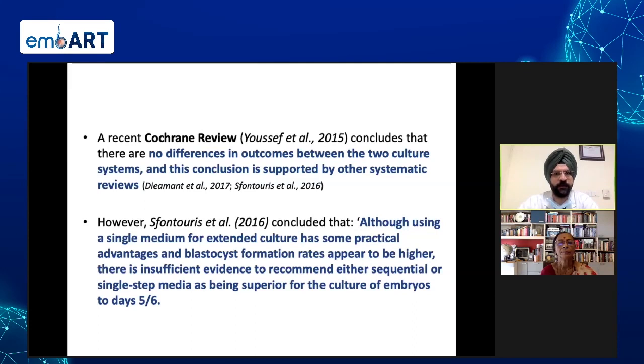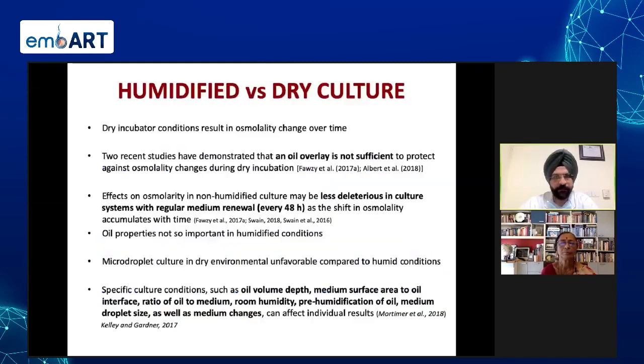If you look at the evidence, a recent Cochrane review concludes that there are no differences in outcomes between the two culture systems, and the conclusion is supported by many systematic reviews. Although using a single-step media for extended culture has some practical advantages and blastocyst formation rates appear to be higher, there is insufficient evidence to recommend either sequential or single-step media as being superior for the culture of embryos. So the gist is that there is insufficient evidence. You might be able to obtain higher blastocyst and higher number of cleavage stage embryos, but ultimately the live birth rates are not changing much.